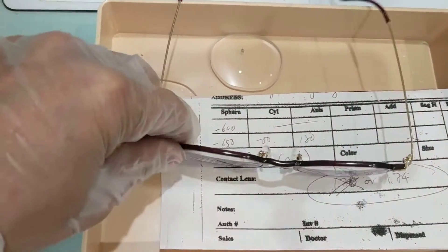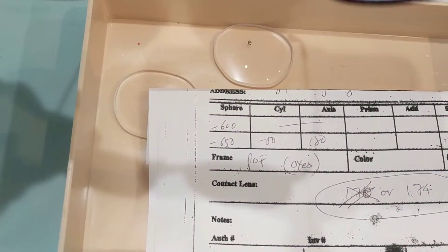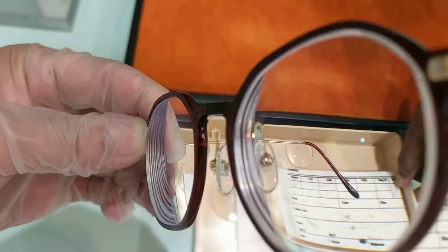Gibson — minus six on the right, minus 6.50 on the left. Got the nose pad first. Look pretty good, pretty thin. Super thin.